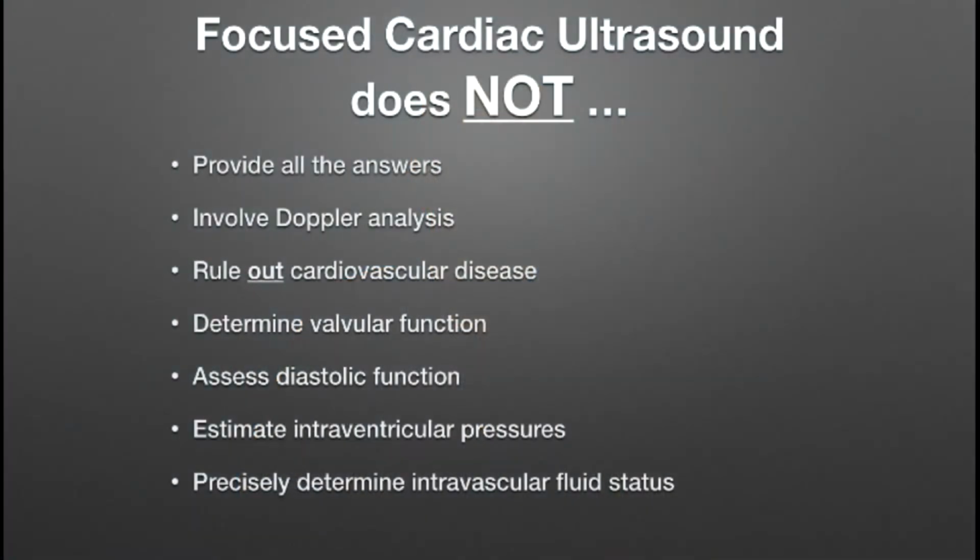Focused cardiac ultrasound does not rule out cardiovascular disease. There's going to be a tendency when you start to learn this, and it has been shown in several studies, that there's going to be a tendency for you to overcall things when you start out. And there's going to be a tendency for you to miss pathology completely. And that's why it is important to remember the limitations of your studies, and you are not able to rule out cardiovascular disease.